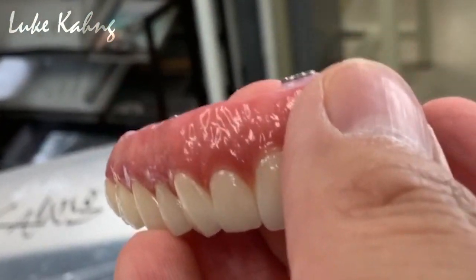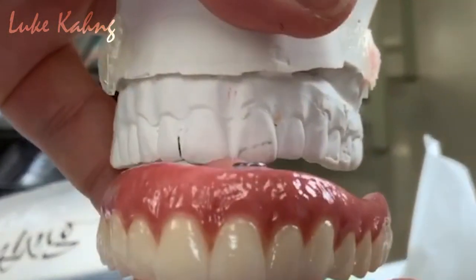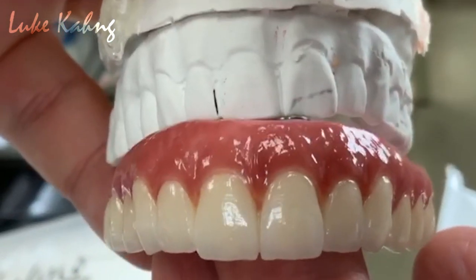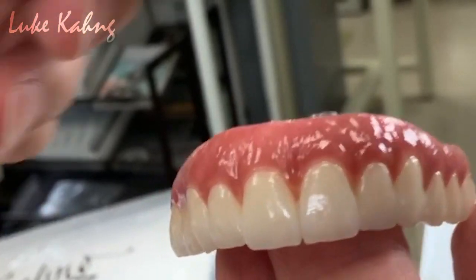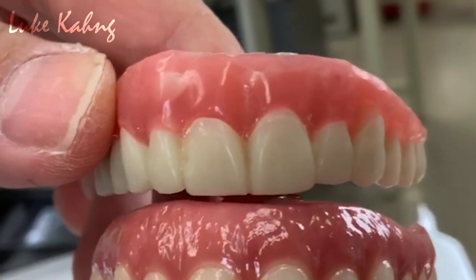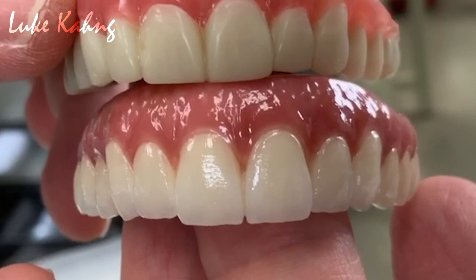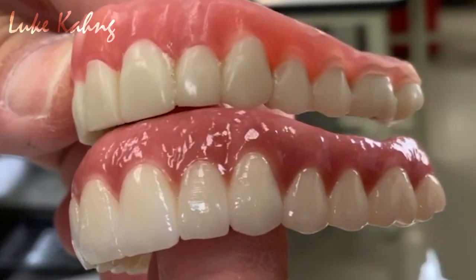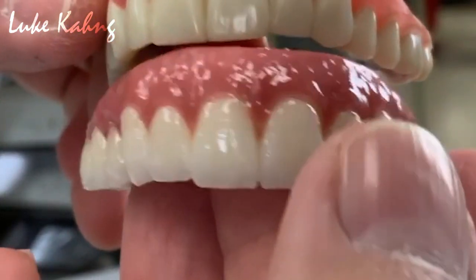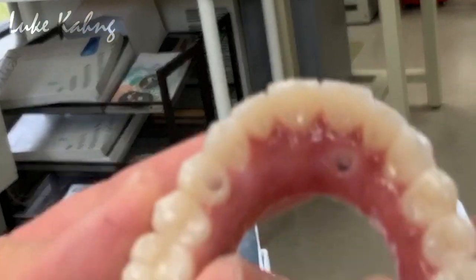Trying to make the nice temporary. See these nice colors, texture is great, and here is the template, which is PMMA, but looks like the teeth, naturalism as close as possible, with more detail. All right, and here's the occlusion.